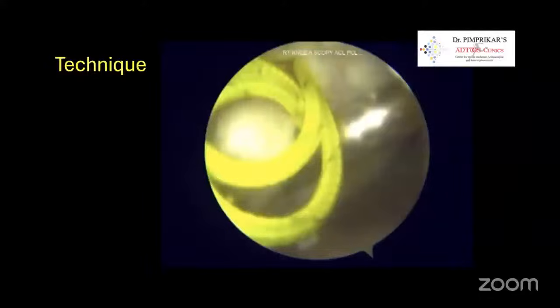ligaments. The patient also had a bucket-handle tear of the medial meniscus, which was initially sutured, and that's a stable meniscus rim with a stable root there, completing the procedure of a single bundle ACL reconstruction.